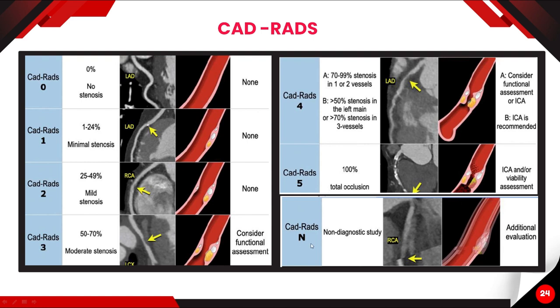For CAD-RADS N, we will advise additional evaluation to diagnose coronary artery disease.